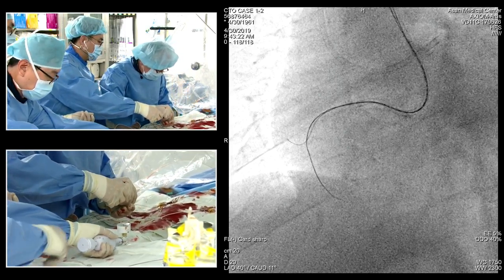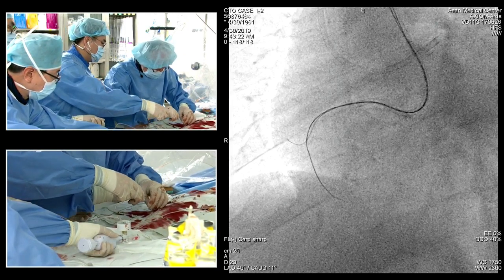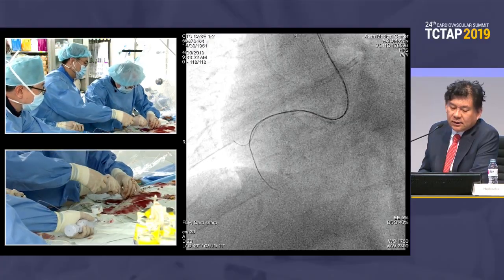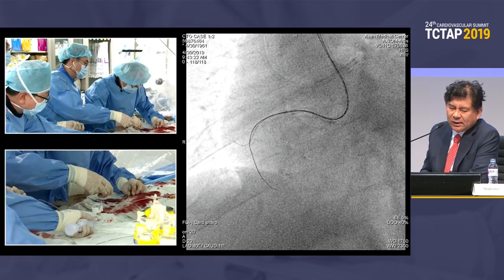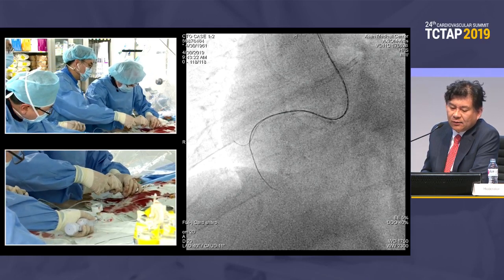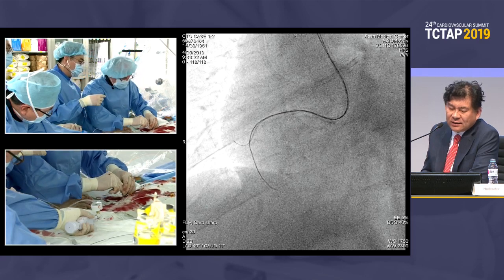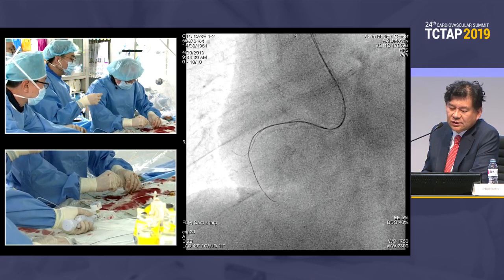Dr. Werner? Yeah? I'm Dr. Ra from Korea University. You remember me at the CRT? Yes, of course. For the CRT last time. Yes, the XTA is actually available in Korea. We are using either XTA or the XTR. So do you have any particular reason to choose the 0.8 gram conventional XT for this initial wiring?